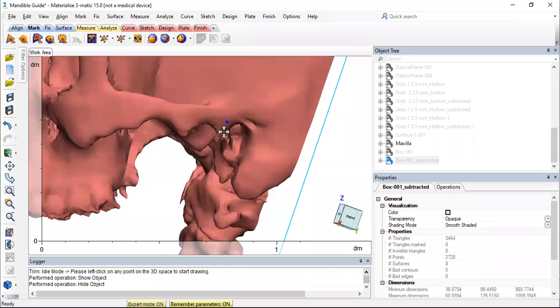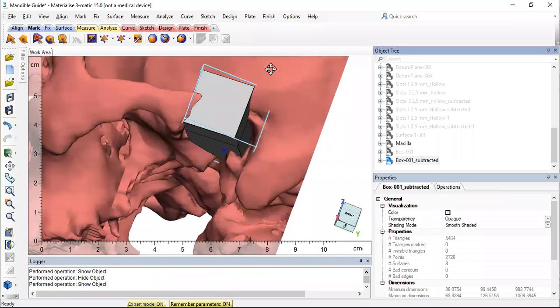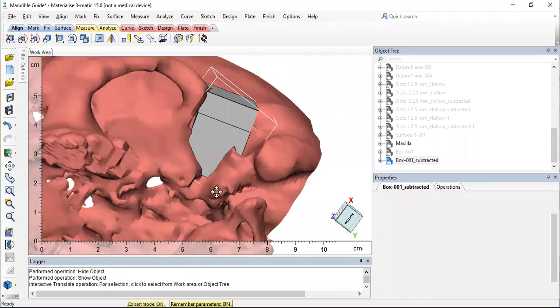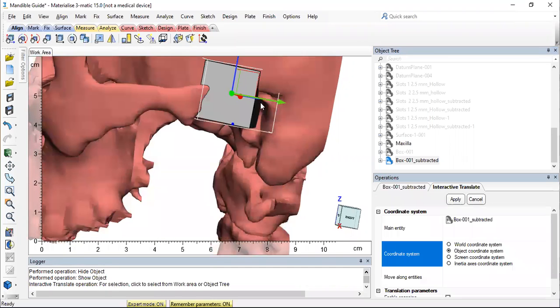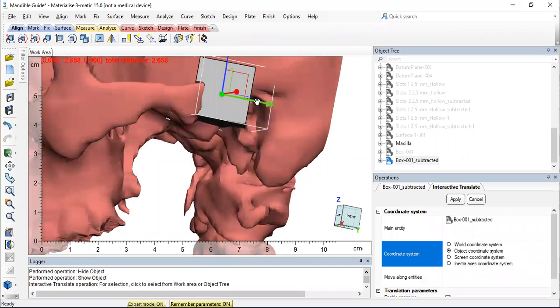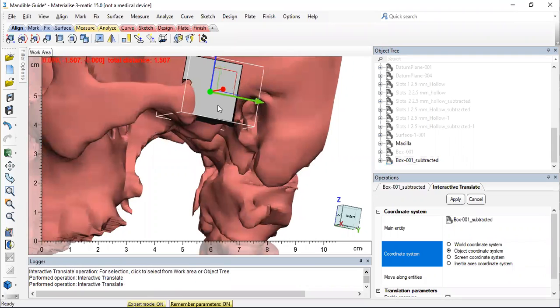अगर अभी हम देख रहे हैं तो this is how the box looks like. So the box placement is actually not correct right now. We'll have to move it ahead. मैंने अभी side view से देखा तो देखा कि वो earlobe के अंदर जा रहा है. So the size, the dimension of the box is not correct. Basically, it should be placed somewhere here. Yeah, this is the actual placement of the box.